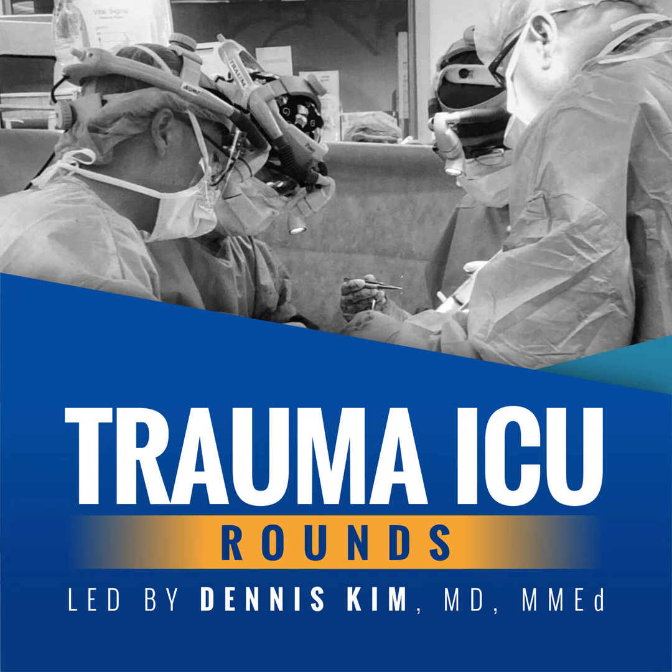And we see this all the time when patients have acute cardiogenic pulmonary edema and you put them on some BiPAP that helps to decrease the afterload, thereby augmenting cardiac function. But the opposite applies when you're extubating someone. So when you're taking someone with a bad LV or low EF or poor LV function and you remove positive pressure ventilation, they don't like that. All right. Poor LV likes positive pressure ventilation.